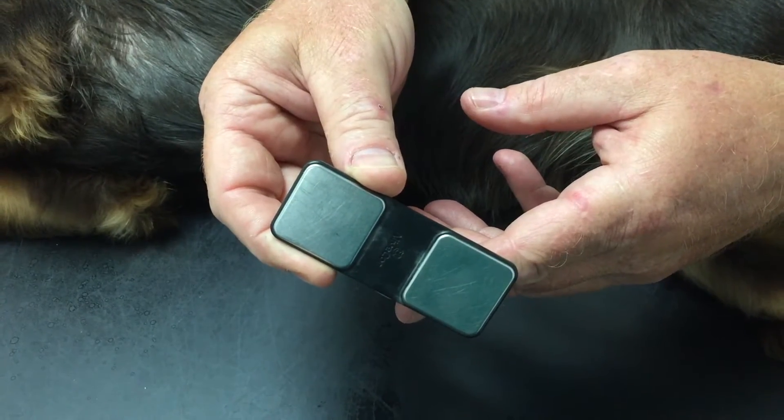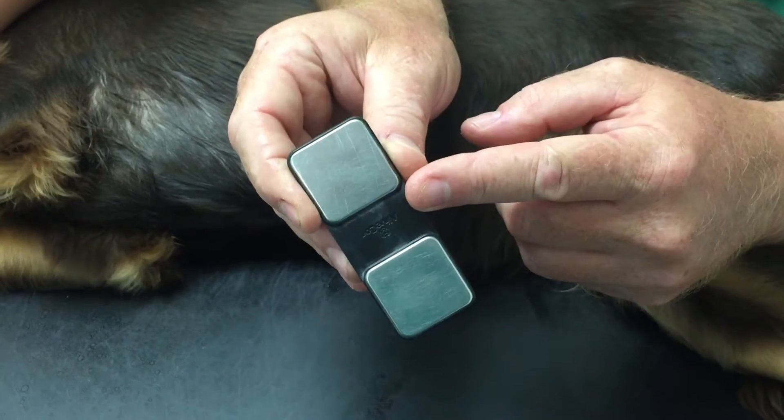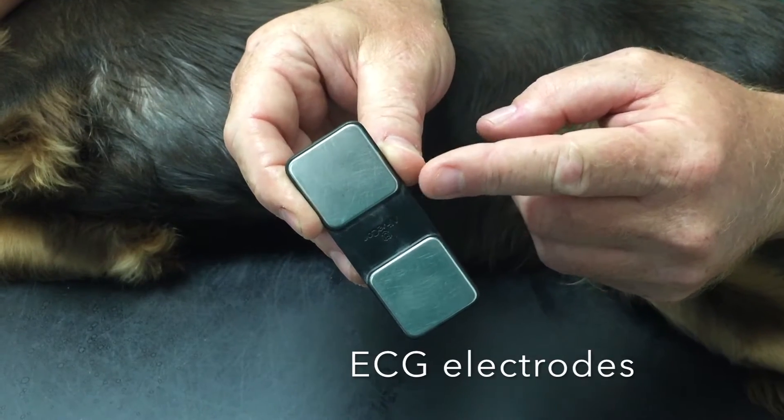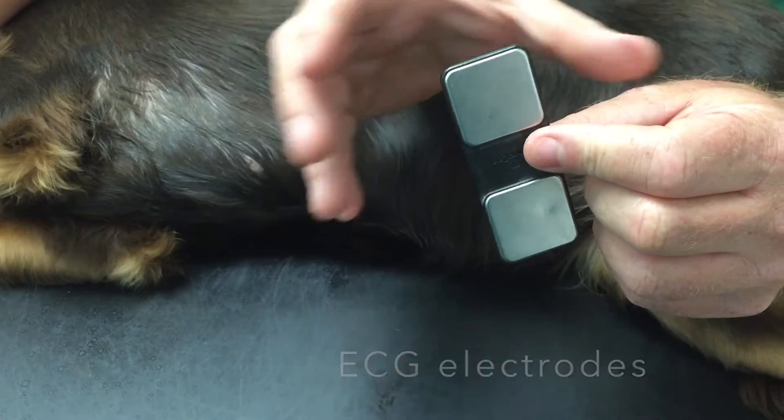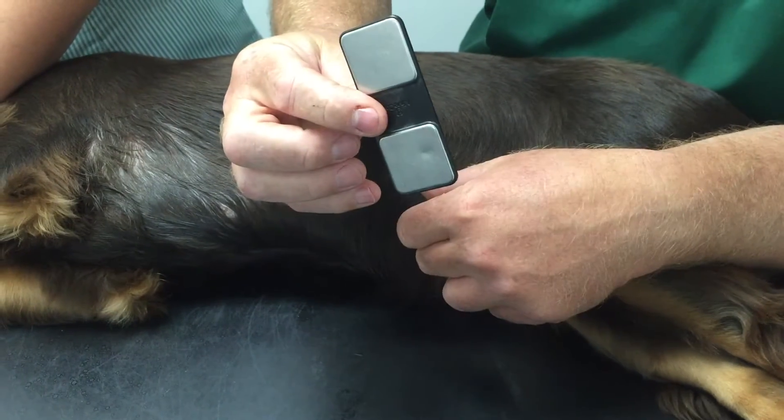When you purchase the device, it comes in two parts. First, the ECG electrodes, which is this part — and the clever part. The second is the back that comes with your phone, depending on the size of your phone. But that part is not needed to use it as an ECG machine.